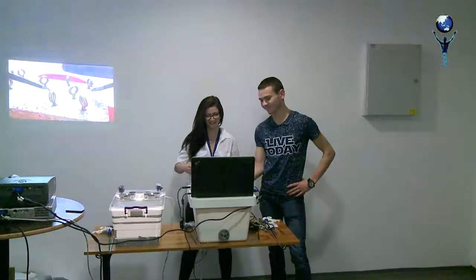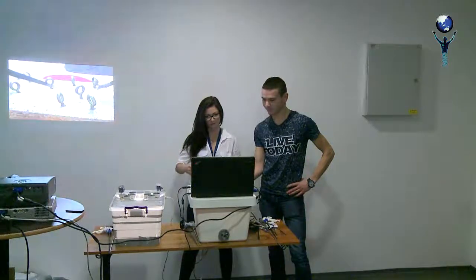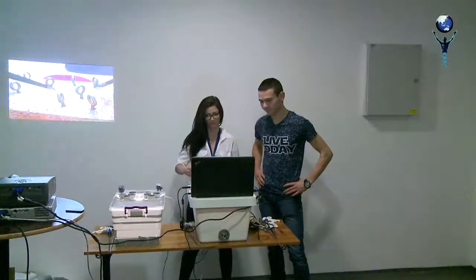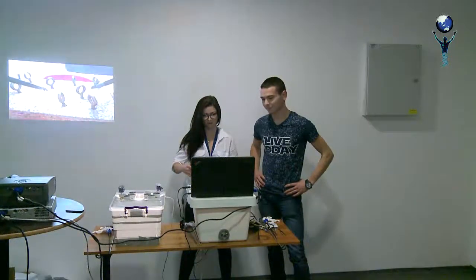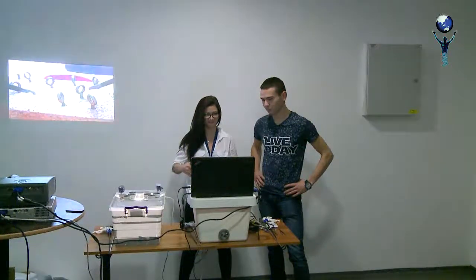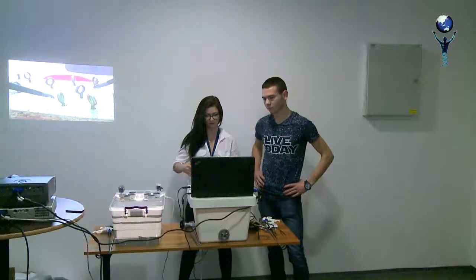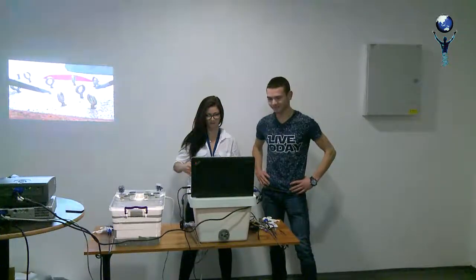When some trainee starts with laparoscopic surgery, there is a syndrome like a sleeping hand. You work only with one hand, and the other is sleeping, just does not help you. And it may take a thousand hours of performing before you can practice with two hands. So, the right hand is sleeping, now the left hand is working.